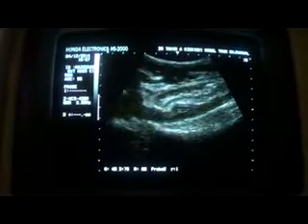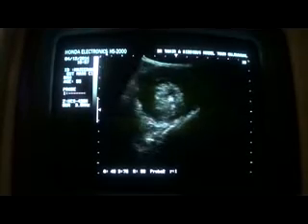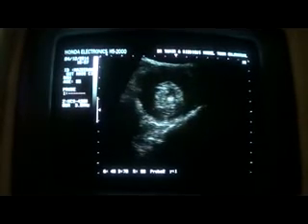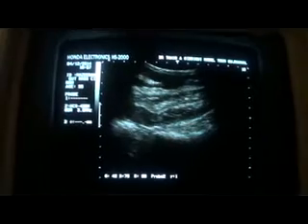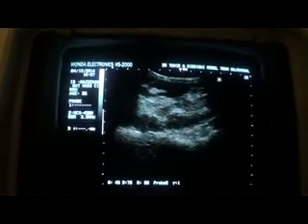This is the longitudinal section once again, and this is the transverse section, and this is the lumen, and this is the thick mesentery, this area, this is fluid. So this is our case of the day. Thank you very much.